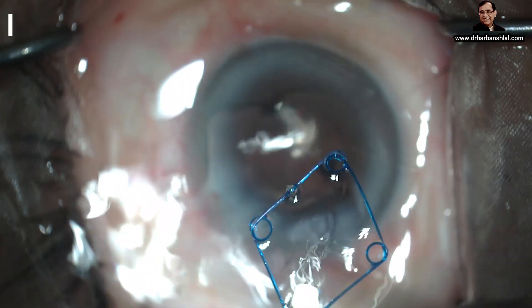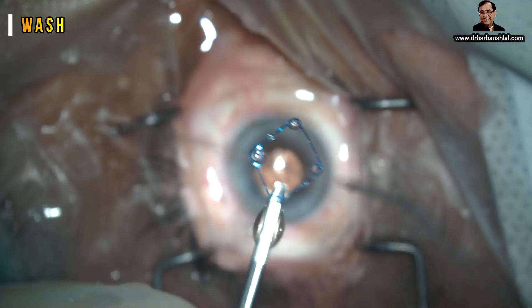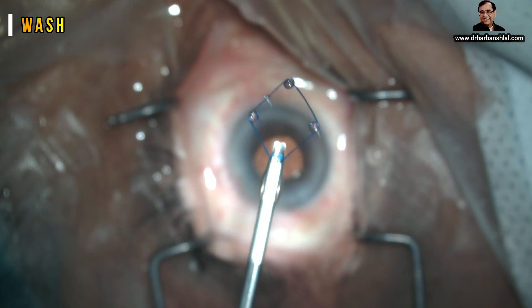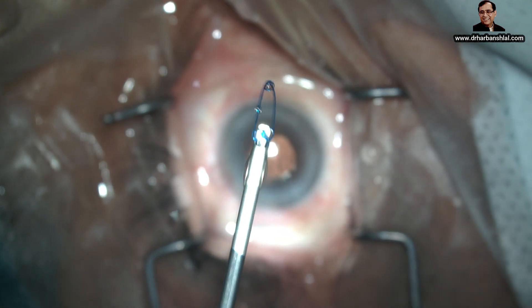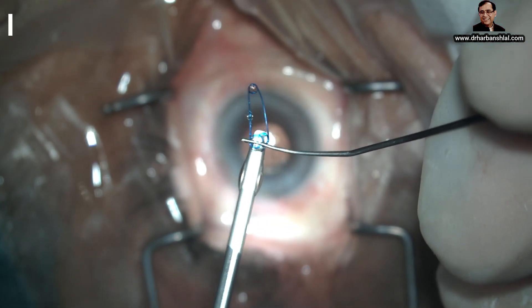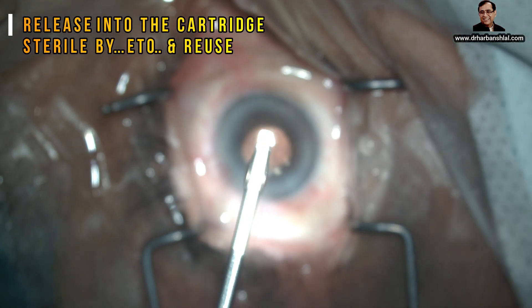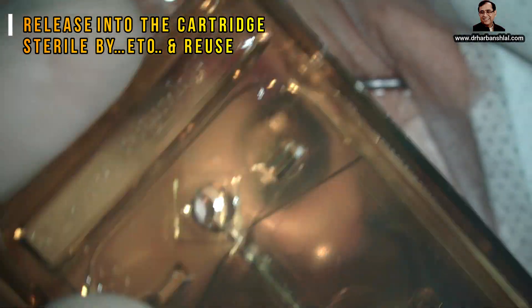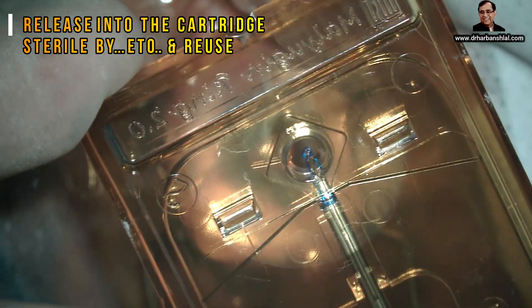Now wash this thoroughly to wash out all the viscoelastic. Once all the viscoelastic is washed out, you can reload it into the cartridge. Take the cartridge, push it, and it is released into the cartridge. Now dry it, sterilize it, and you can reuse it.